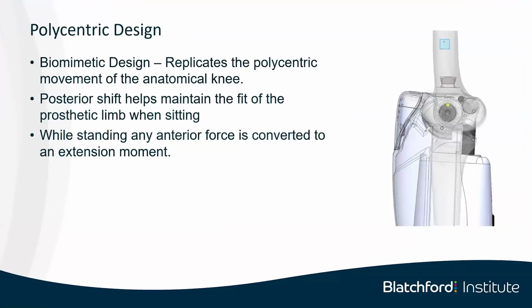The polycentric design is not purely about increasing stability. Okay, so we are replicating the polycentric movement of the knee, and there does seem to be something in this. Those of us who are used to using polycentric knees for our K2 and K3 patients are used to the fact that patients feel lighter because of the way the leg rotates on them. And certainly my feedback from fitting this unit in clinics on real patients is that it doesn't feel as heavy to them as you'd expect. No, it's not that bad. And again, I think part of that's got to do with this natural motion of the knee, how it keeps the socket coupled to them better so that they actually feel more stable.